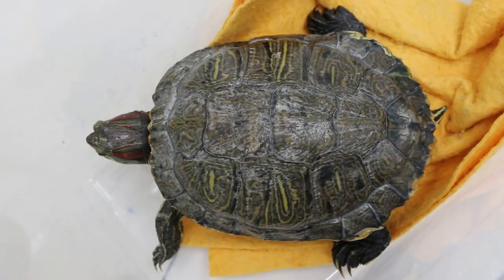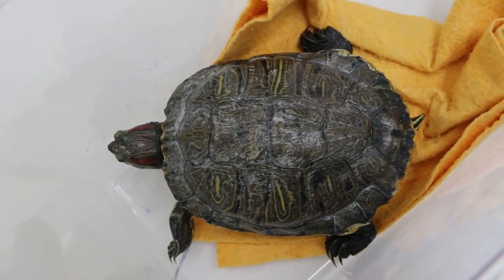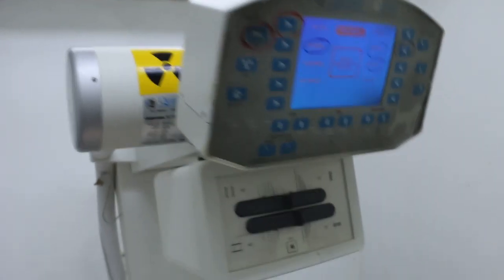This is a female tortoise, five years old. Probably first time having eggs, laying eggs. So this is an x-ray, so I will wear my — go and do the setting first.